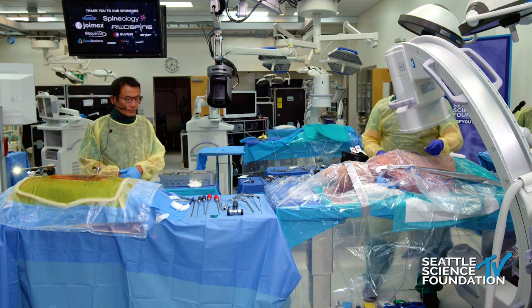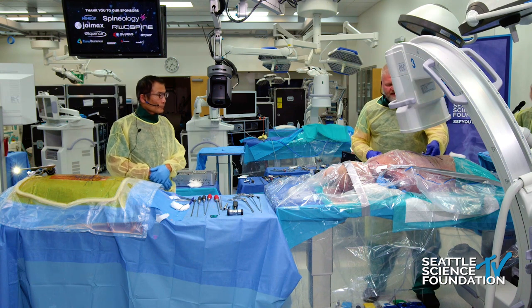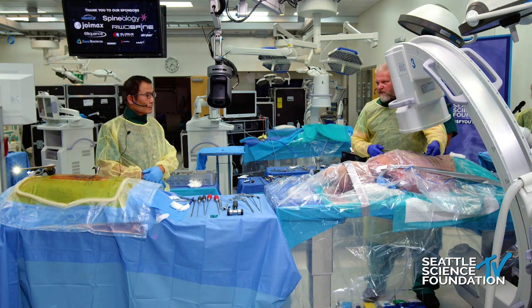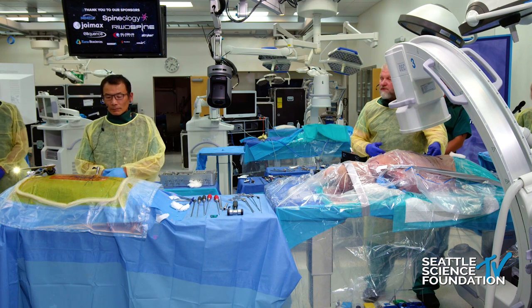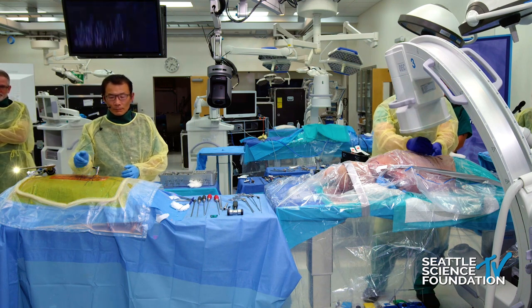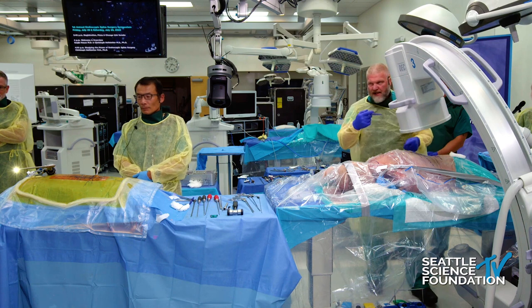So I like to get a nice orthogonal view of the disc space and get an image. We're going to go to L4-5 here, the shot there. So you can see we're lined up with the disc. I draw this line, and then we get a lateral.